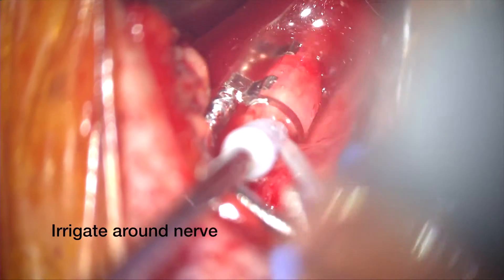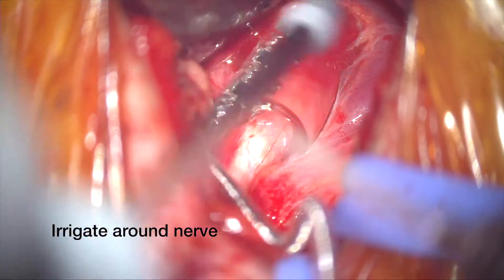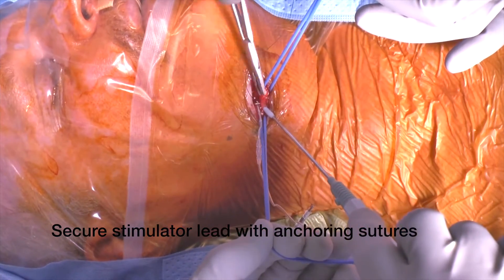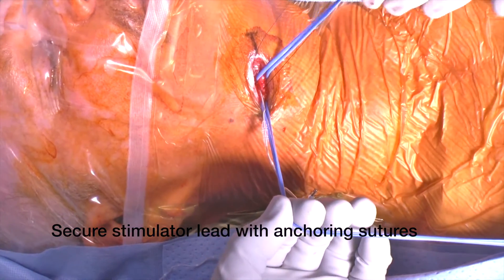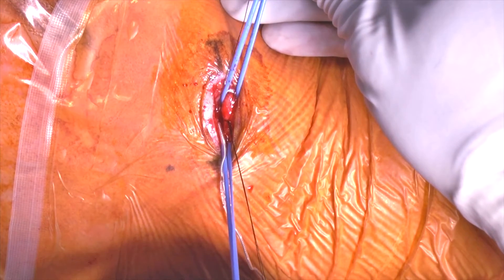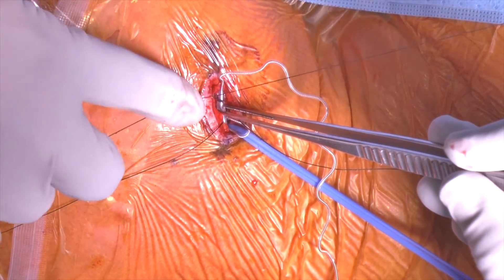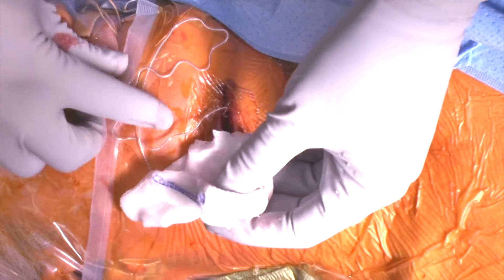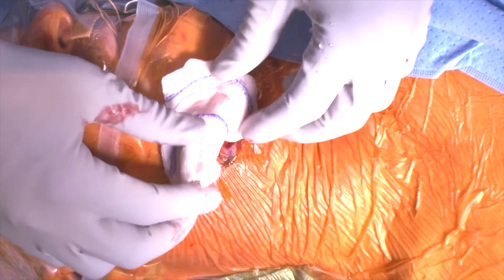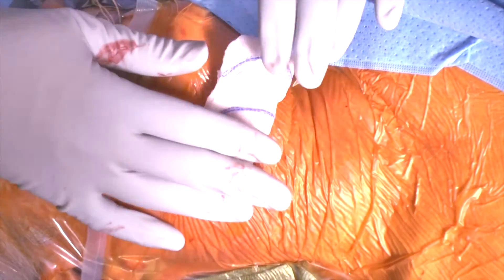Once the cuff is around the nerve, we irrigate the nerve to get rid of any blood clots or debris that's fallen between the stimulation leads and the nerve. Now we're going to secure the anchoring point of the stimulation lead to the tendon of the digastric muscle. These are two 3-0 silk sutures which are tied to the tendon and then we place the anchoring point of the lead to the sutures. I like to wrap the lead in a wet raytec to prevent accidental removal of the lead and to protect it from infection, then place it near the incision while we move on to the next portion of the operation.